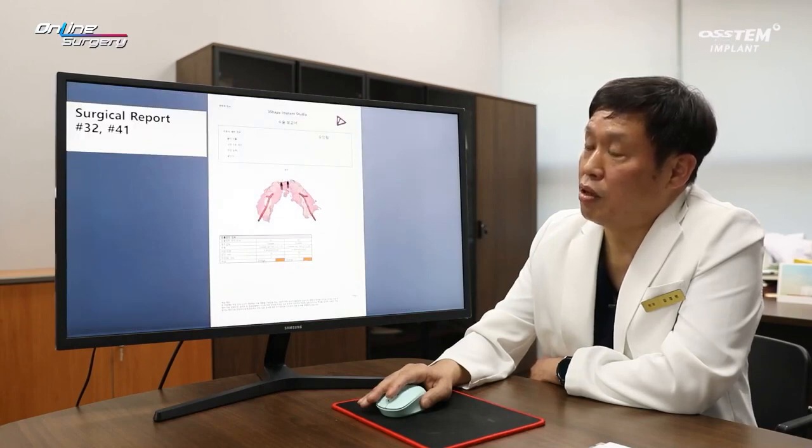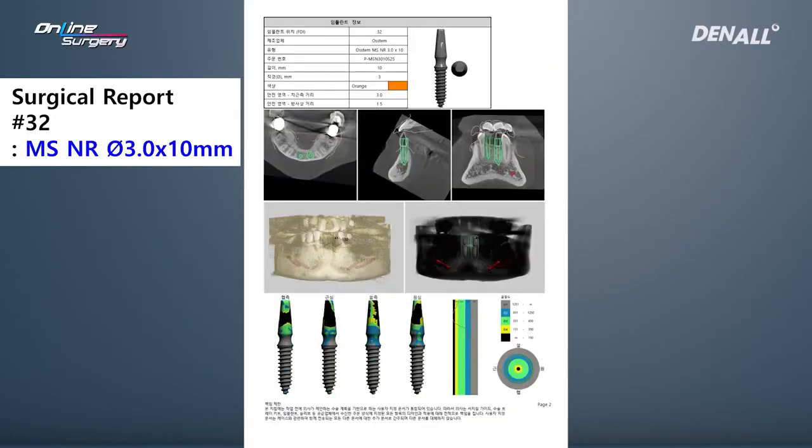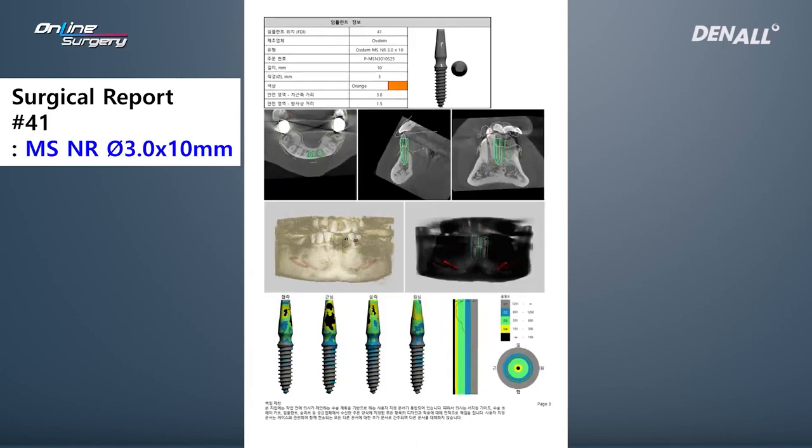I am going to use one MS kit for surgery. For number 32 and number 41, I'm going to place two implants. That is the plan.